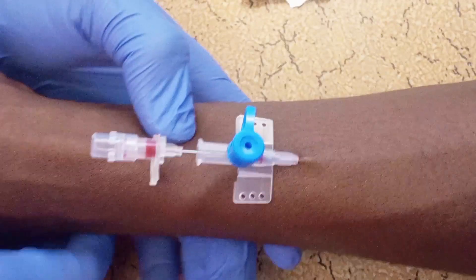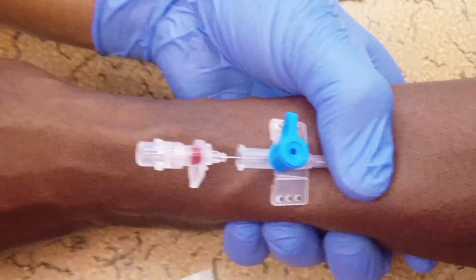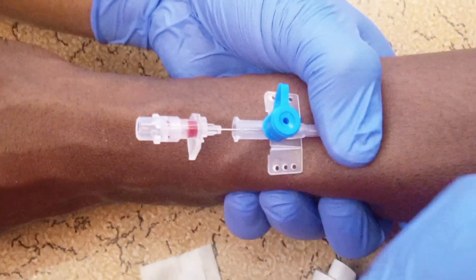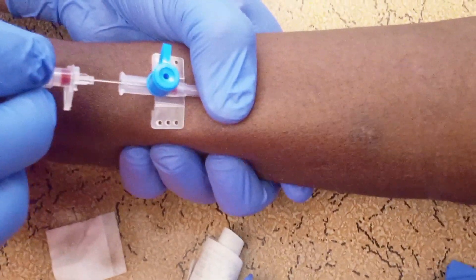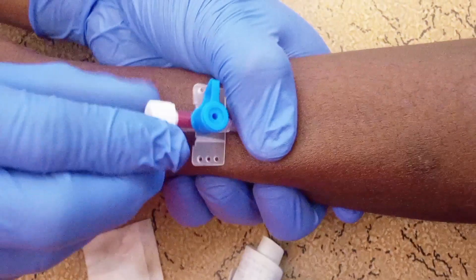Then what you do is apply your thumb on the tip of the vein, or on the tip of the cannula. Then you release the tourniquet slowly, then you remove the needle slowly. Then you attach the cap at the end of the cannula.